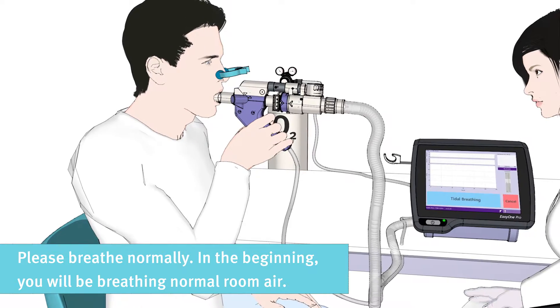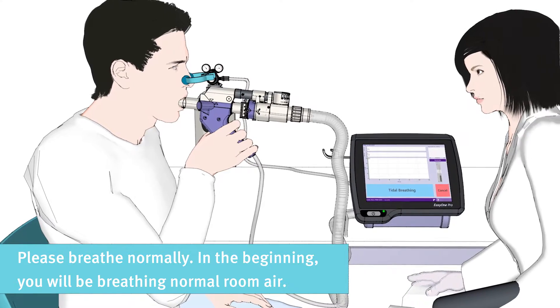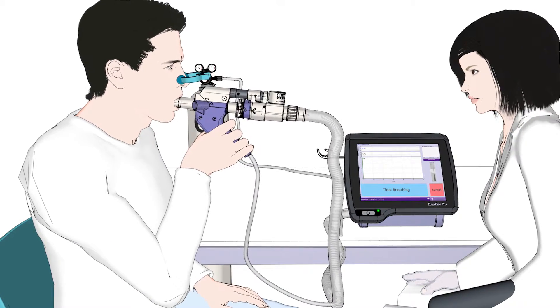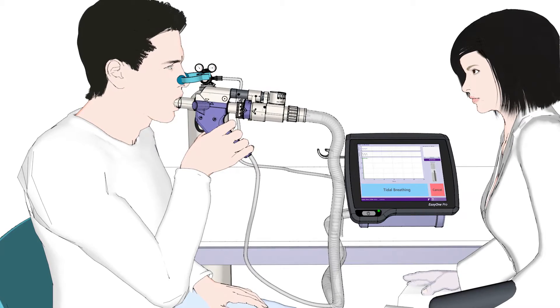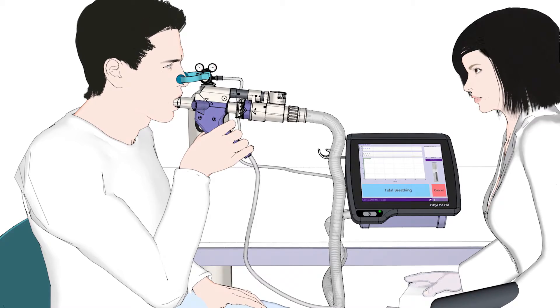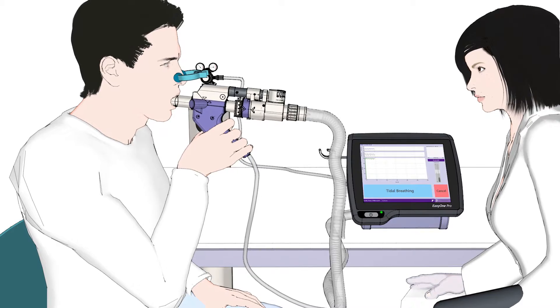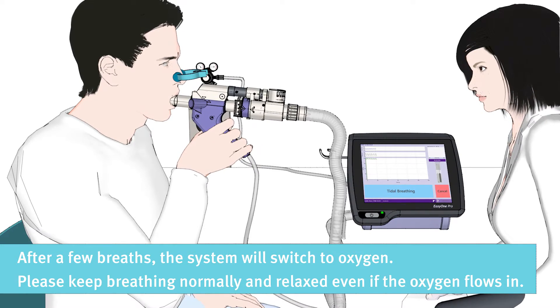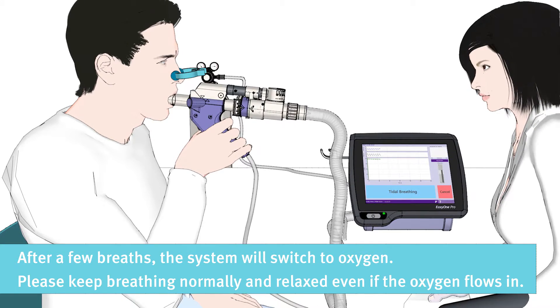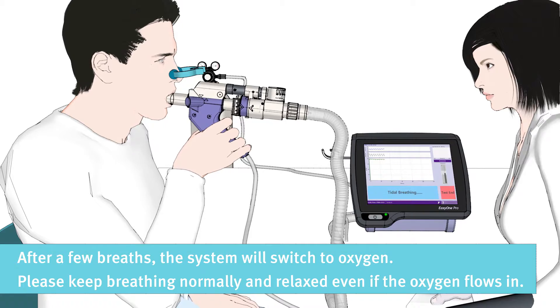Please start by breathing normally. In the beginning, you will be breathing normal room air. After a few breaths, the system will switch to oxygen. Please keep breathing normally and relaxed even as the oxygen flows in.